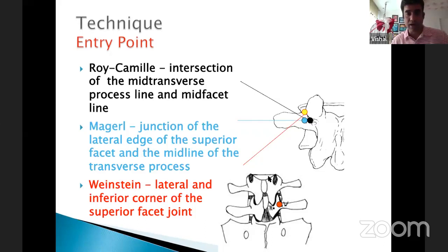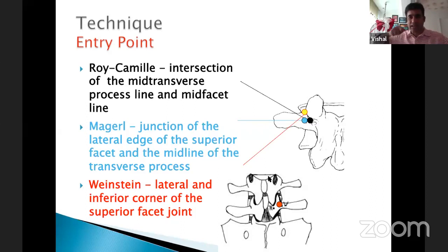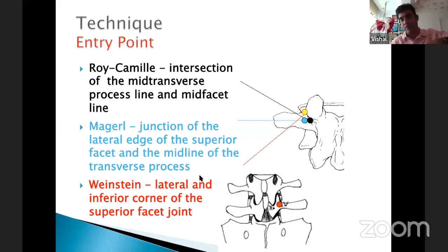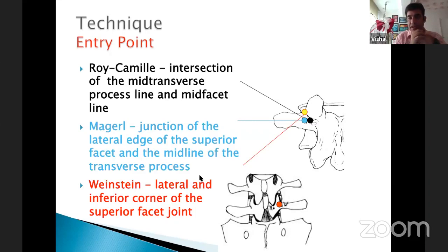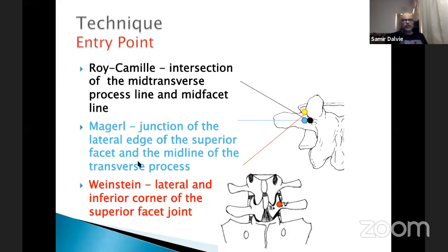In initial cases, sub-periosteal dissection is recommended to reduce bleeding. Try to find the pedicle bullseye under C-arm guidance. Use a lateral entry point for good convergence; a bigger incision prevents inadvertent divergence. Once the entry point is correct, 70% of the job is done. The feel through the awl in cancellous bone is a cakewalk — any sudden jerk or force means cortical perforation, which must be avoided.